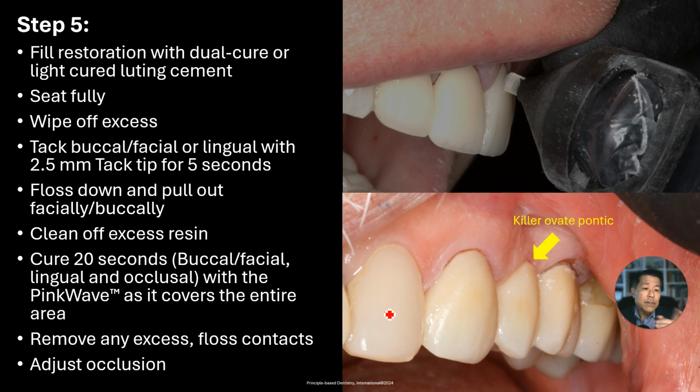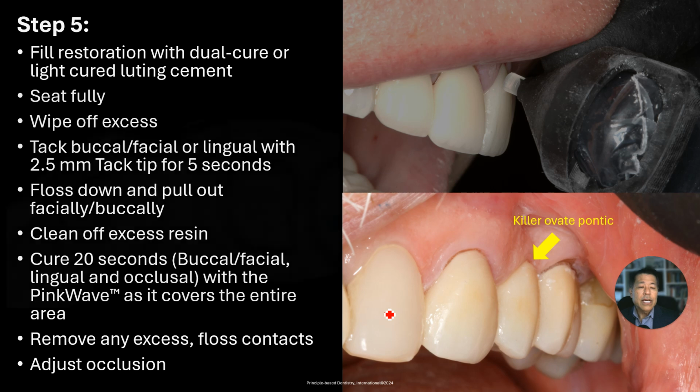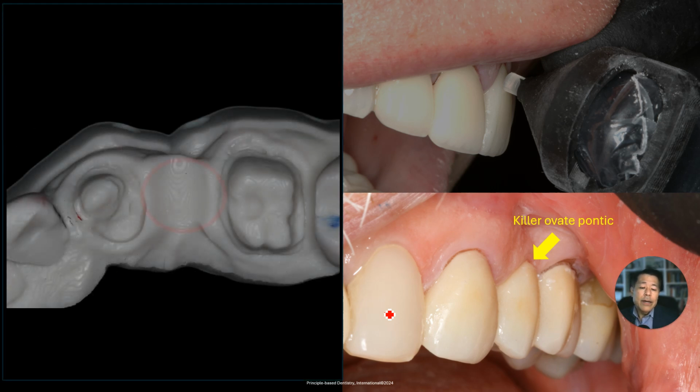Now what I really liked was, look at that killer ovate. So that is the missing tooth, but it looks like that pontic or that tooth is just coming out of the tissue. How did the lab get that? Well, when they created the bridge, they modified the model so it had a little dip there. The zirconia fits into that dip. When I went to cement this, of course, it kind of teeter-tottered there, so I really had to push it down hard.